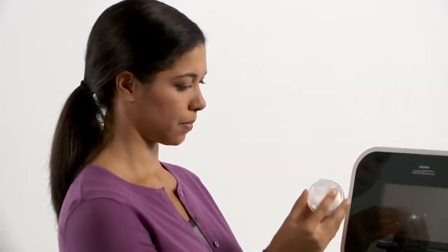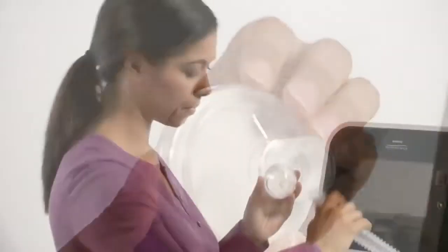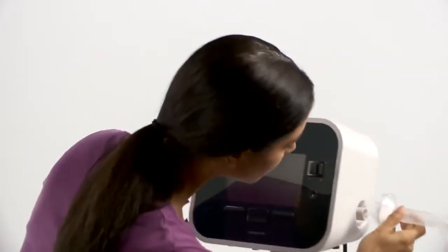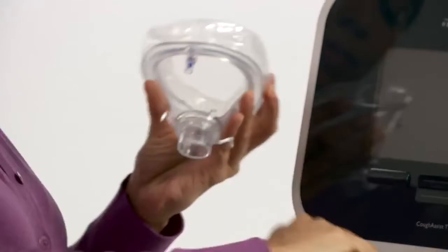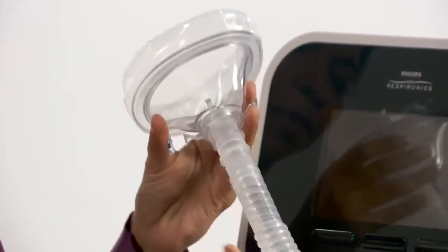To build the patient breathing circuit, attach a bacteria filter to the breathing circuit connection. Attach the circuit tubing to the bacteria filter. Press the filter onto the connector on the side of the device. If the patient will be using a face mask or mouthpiece, attach it to the circuit tubing. If the patient has a tracheostomy tube, place a trach adapter on the circuit tubing.